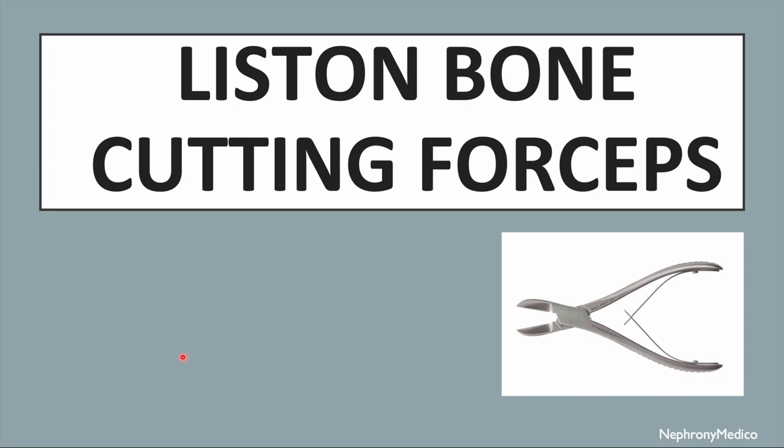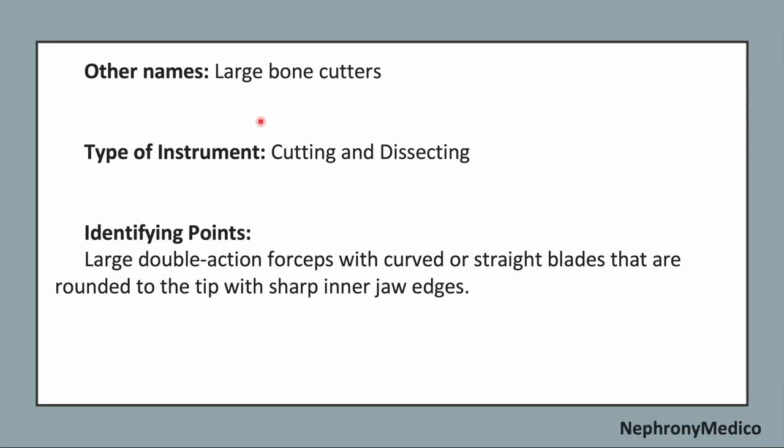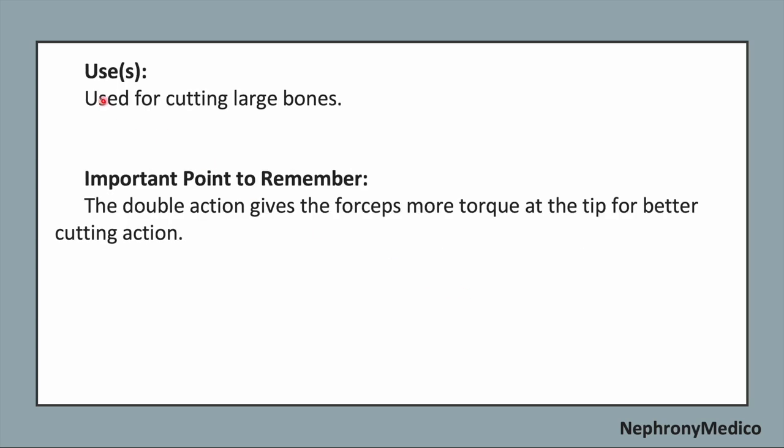Let's talk about Liston bone cutting forceps. This is a picture showing Liston bone cutting forceps. Now, the other name of this instrument is large bone cutters. It is a cutting and dissecting type of instrument. Now, identifying points. It has a large double action forceps with curved or straight blades that are rounded to the tip with sharp inner jaw edges. Use. It is used for cutting large bones. Now, important point to remember. The double action gives the forceps more torque at the tip for better cutting action.